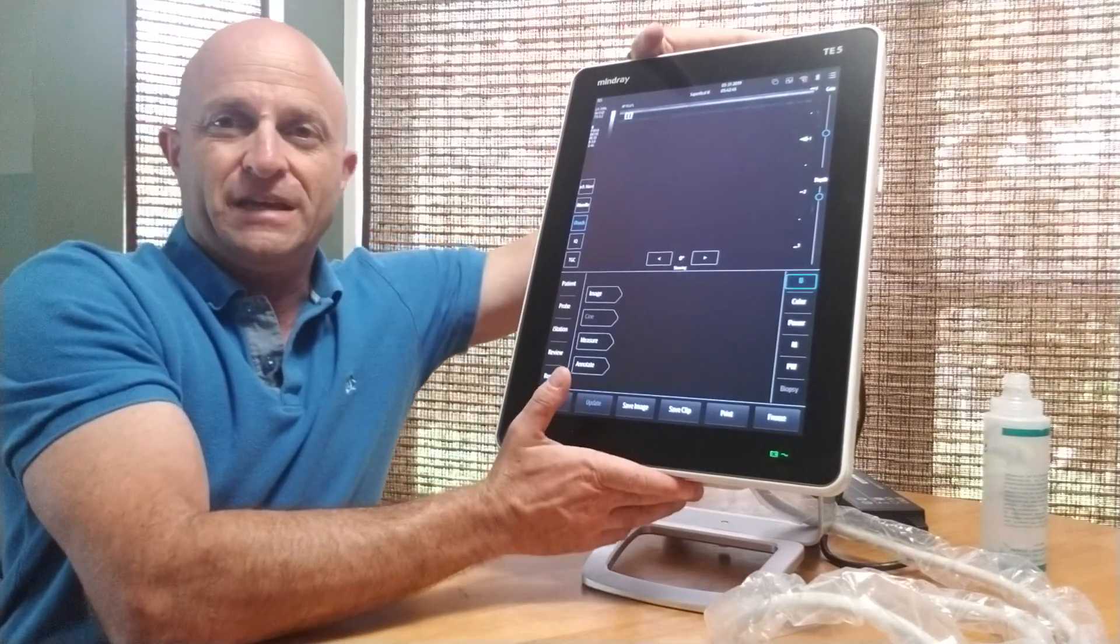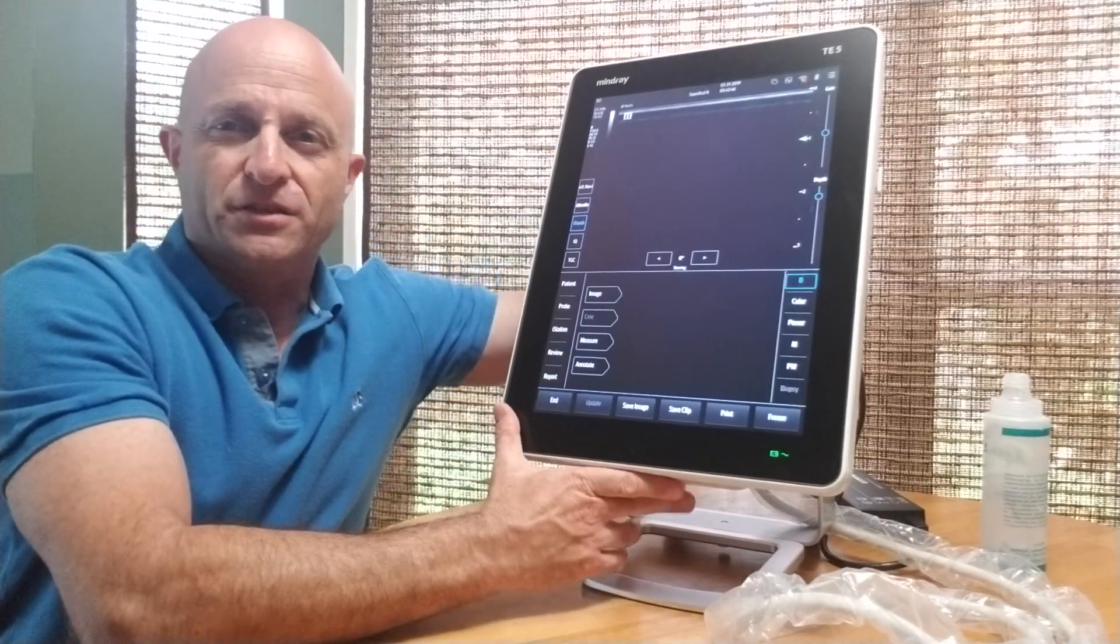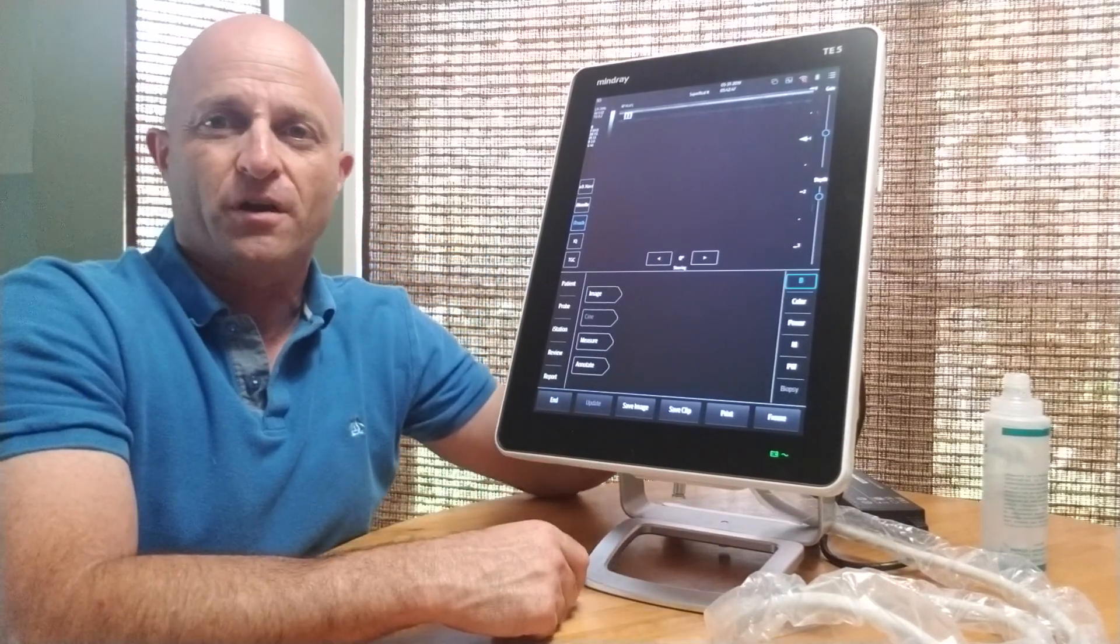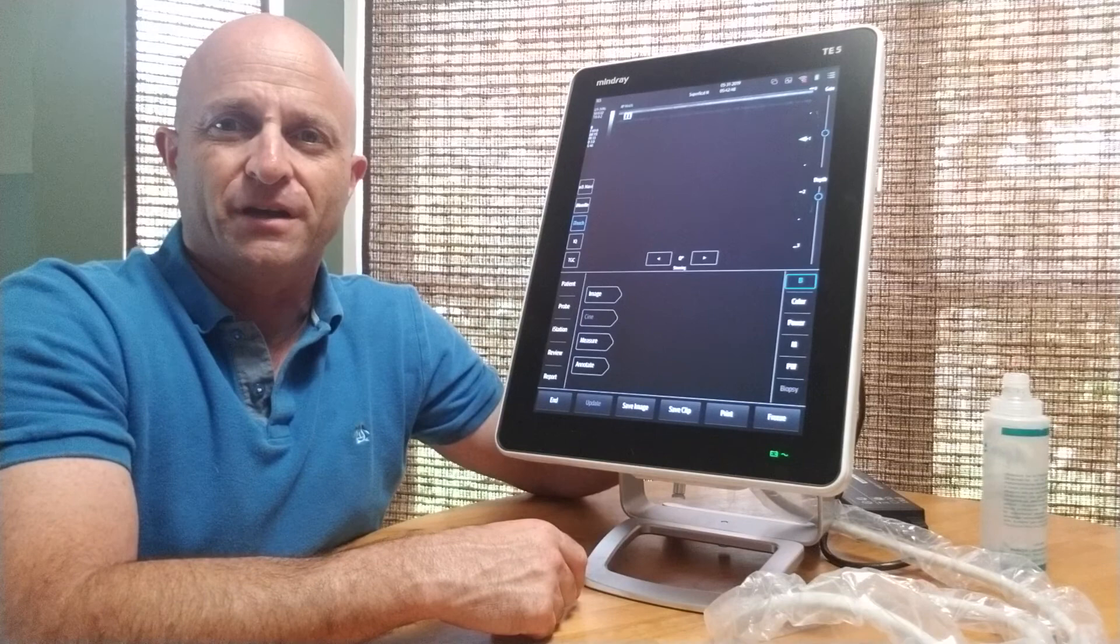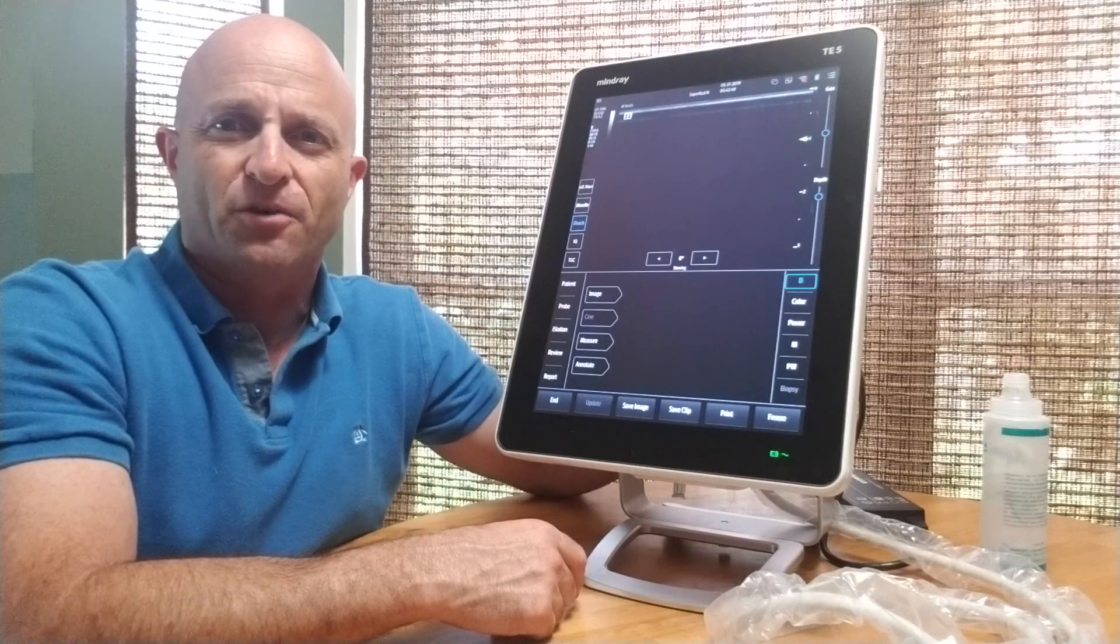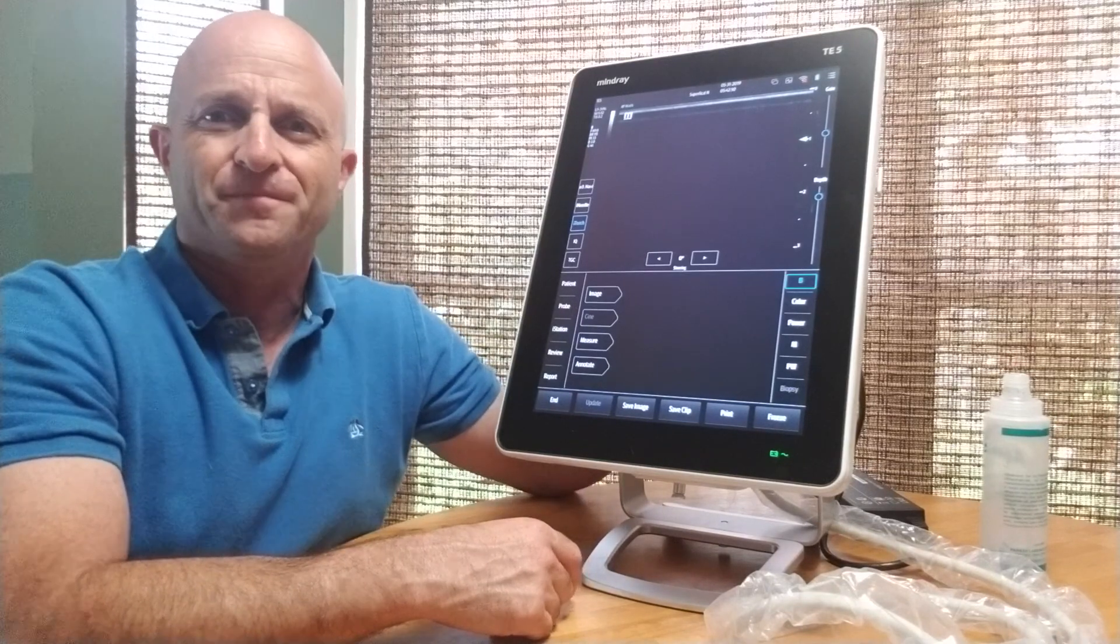So that's the TE5, just a brief walkthrough. I thought I would share and show it off. All right, thank you.